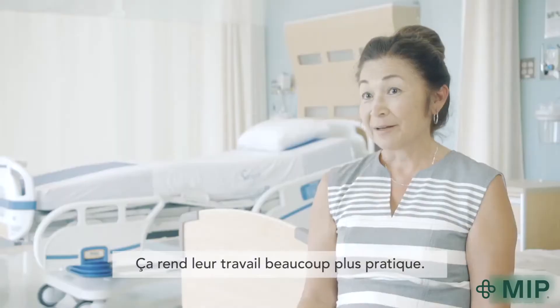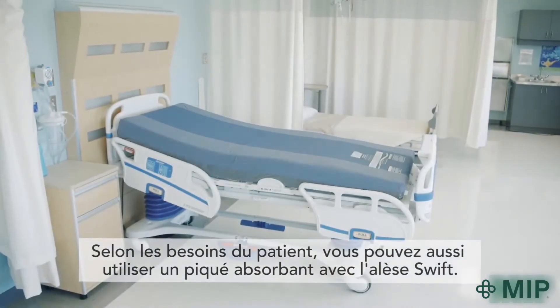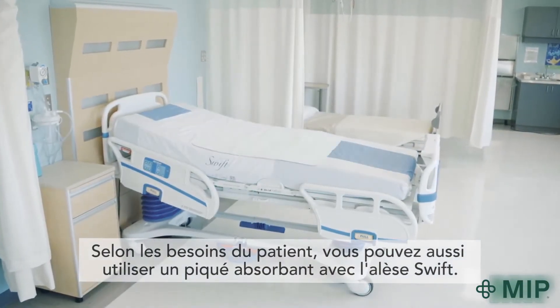You can use the Swift slider with or without a bed pad, depending on needs relating to incontinence.